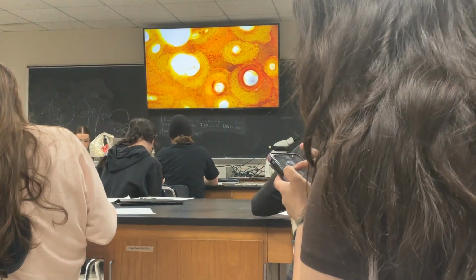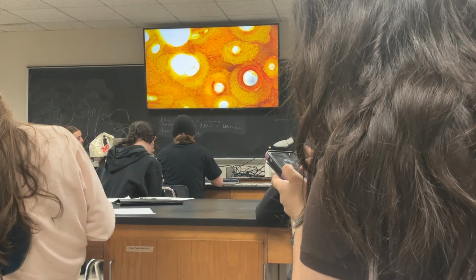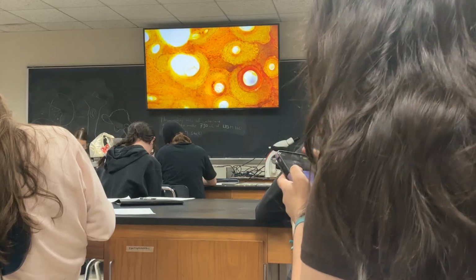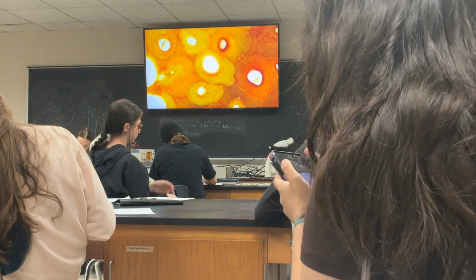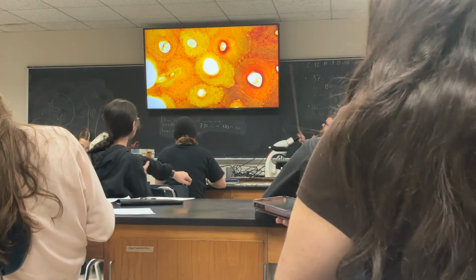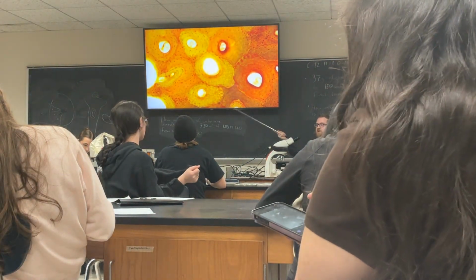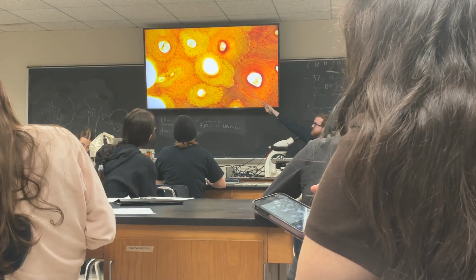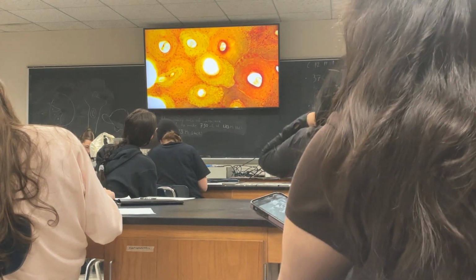You don't need to tell me compact bone, you don't need to tell me spongy bone, you don't need to tell me osteons, lacunae, canaliculi, osteocytes, any of the details that you might remember from other classes. This is what bone looks like. It looks like Swiss cheese. What you're really seeing are these osteons, right? Not just the holes, because you might have like adipose, which kind of looks like giant holes. It's more, okay, I have these donuts that are sandwiched together. That's bone. Okay, but I don't think I need to expand too much more on that. That's, I think, the easiest one here.